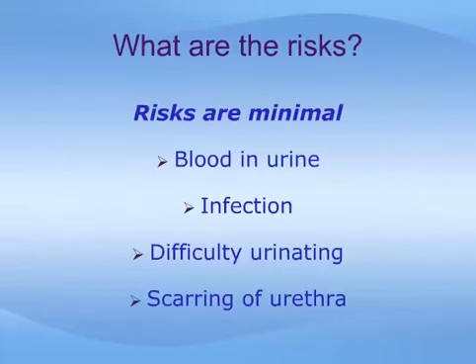Cystoscopy is a commonly performed low-risk procedure. As mentioned, blood in the urine is common afterwards and usually clears quickly and is of no consequence. There is a low risk of infection, likely less than 1%, and this is minimized by drinking plenty of fluids after the procedure. In some situations, and with certain doctors or clinics, antibiotics may be given around the time of cystoscopy. Some patients may experience difficulty urinating after the procedure, or more frequent, urgent, or painful urination. This can be lessened by focusing on relaxing the pelvic muscles when urinating.